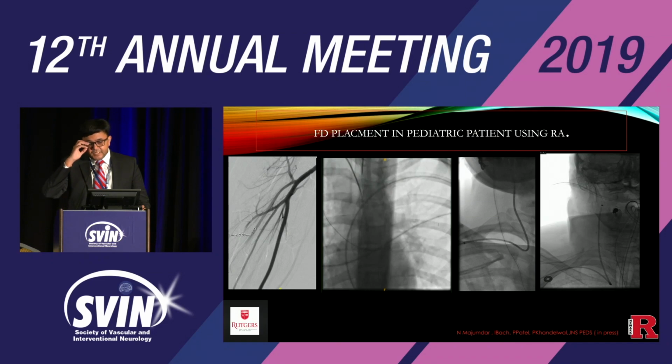So this is the case we did in a 15-year-old patient, a very young girl. I was worried about spasm. Artery measures only 2.8 millimeter, but she was intubated. So that's the thing. If you want to try, at least in young females, make sure the patient is heavily sedated or intubated. That makes them less anxious, and the artery goes bigger in diameter.